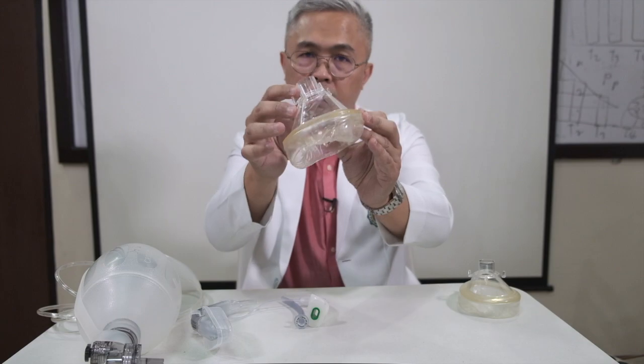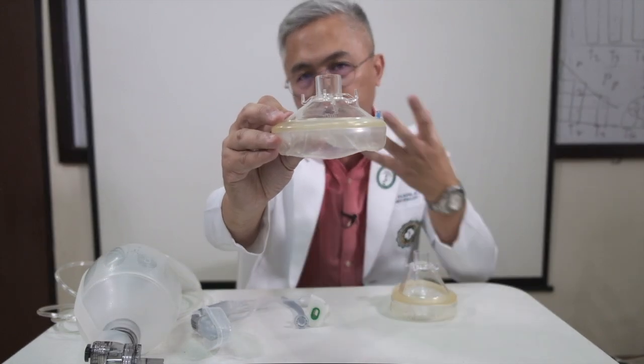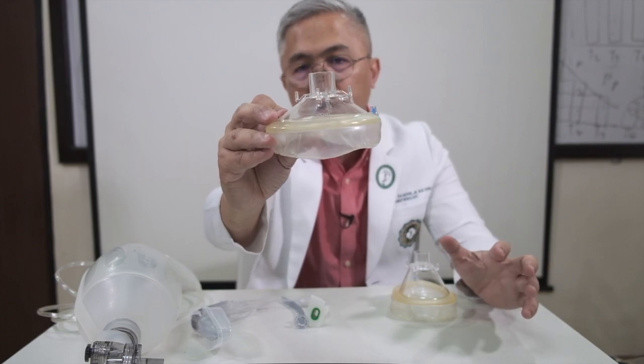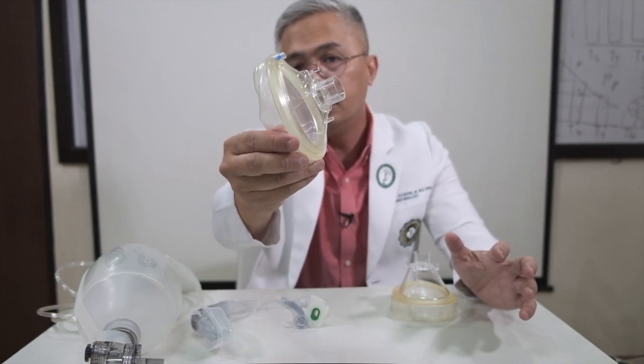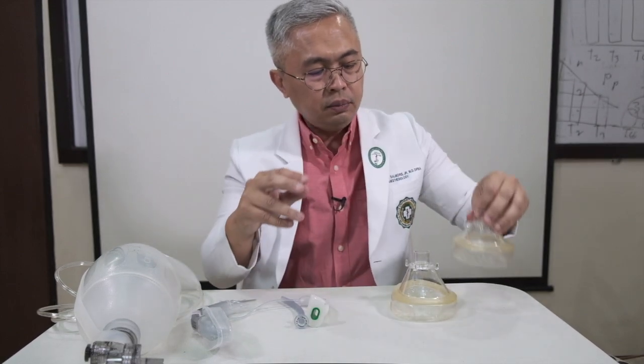Okay, it's clear, single use. It's very effective. This is a smaller size for a smaller sized patient. You can use this for pediatrics as well. We have smaller sized face masks for babies and all that.